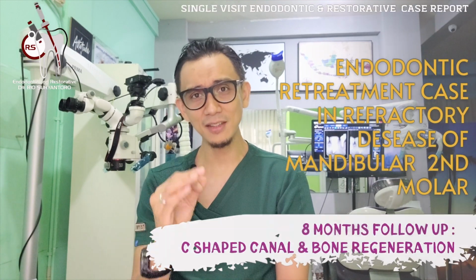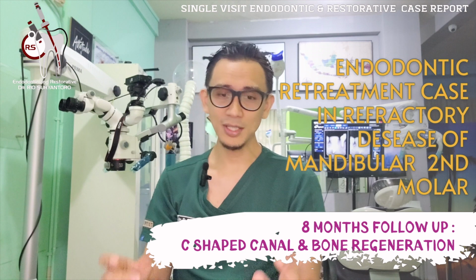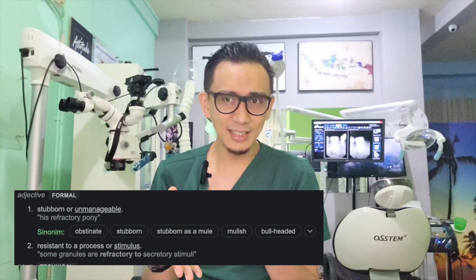Today I'm going to share with you another clinical case report of a single visit endodontic retreatment in a mandibular second molar, which has a C-shaped canal and refractory disease. So what is this refractory disease? It is a disease that is unmanageable, so stubborn, and still exists even after being treated by another operator.